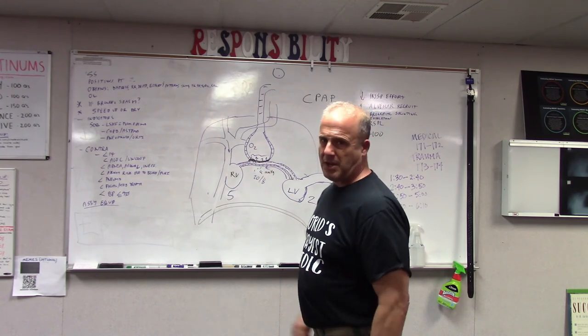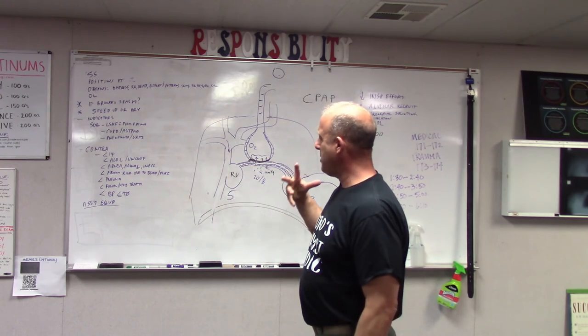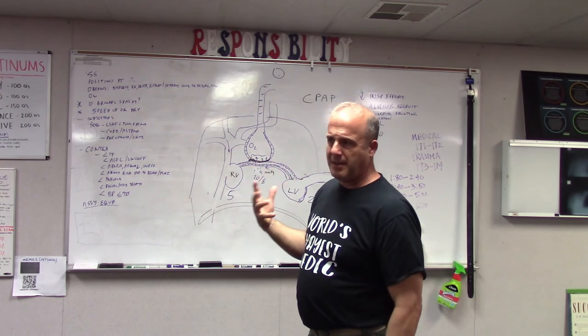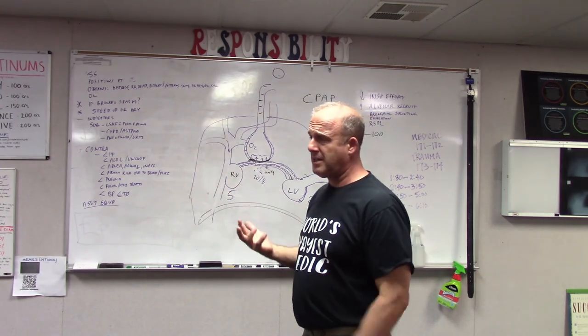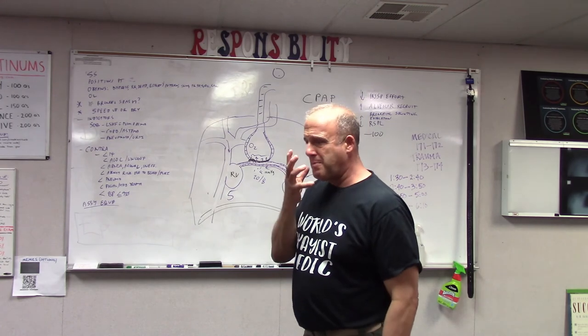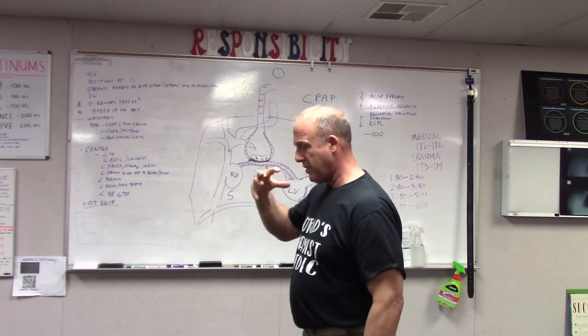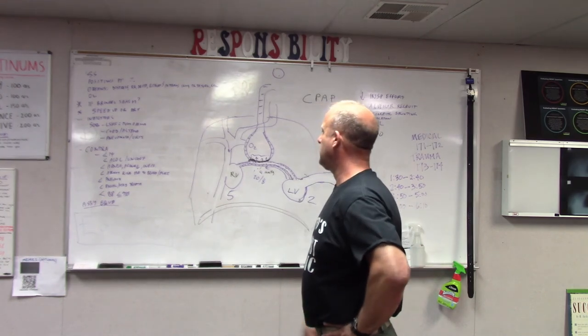Puke, same thing. If they're nauseated, give them some Zofran. But the big thing is, if they do have a risk of puking or they're bleeding, you could try the CPAP. I'm trying to picture a situation where you have a massively jacked up face and pulmonary edema or bronchospasm. But you could try putting on the CPAP and then open it, drain, put it on, open it, drain. Your capno will be useless at that point, but just thoughts.